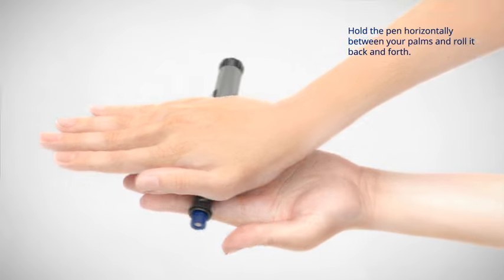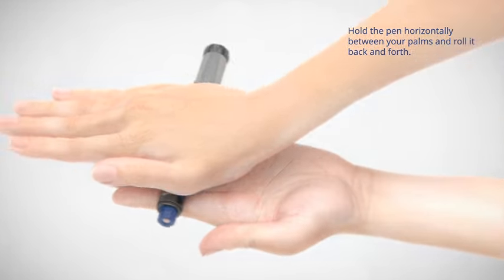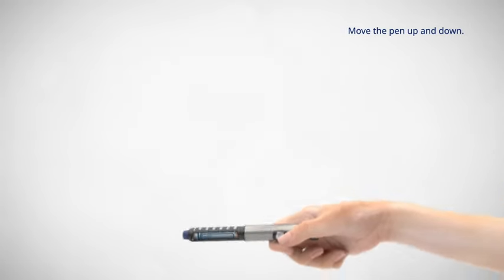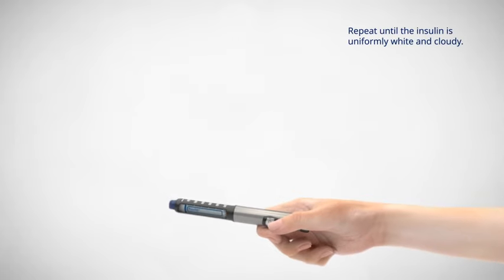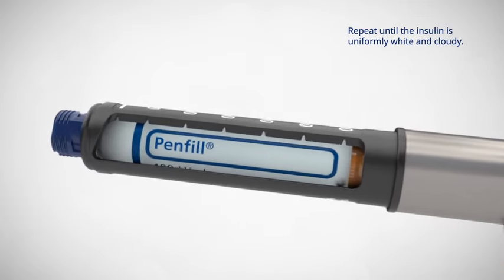Hold the pen horizontally between your palms and roll it back and forth. Move the pen up and down. Repeat until the insulin is uniformly white and cloudy.